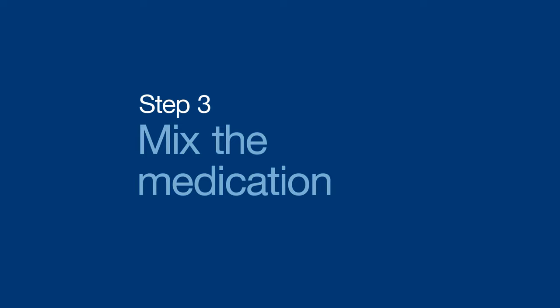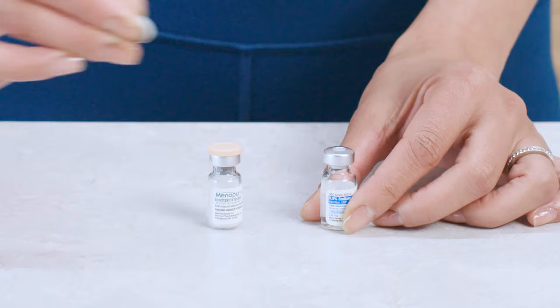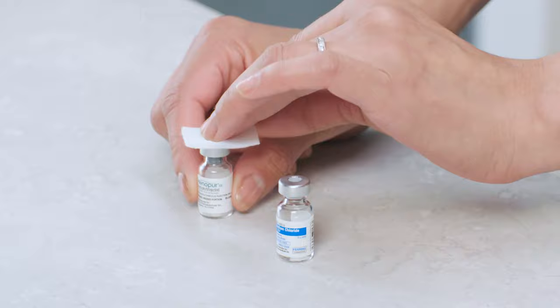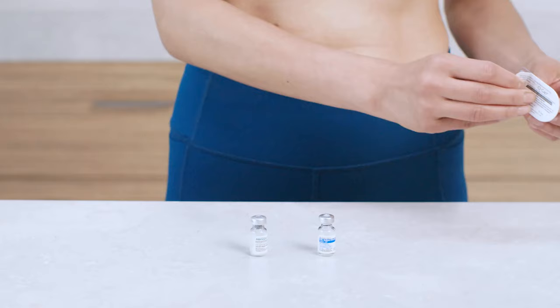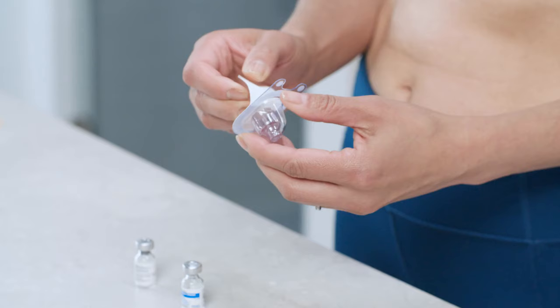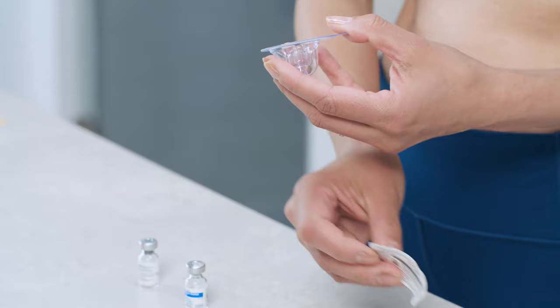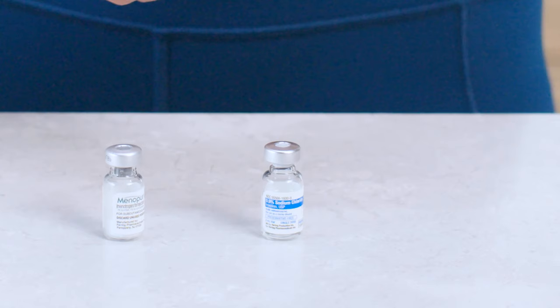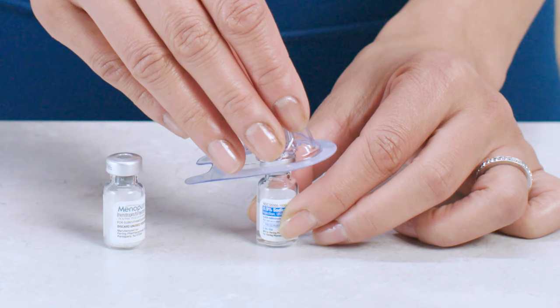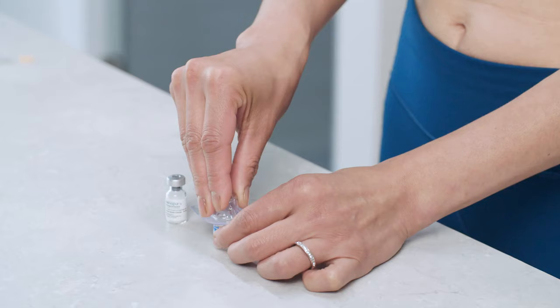Up first, you're going to mix the diluent with the powdered Menopur. To get started, remove the caps from both vials and wipe the tops of each with an alcohol swab. Then peel open the Q-Cap pack — you'll want to keep it in the package for the next step, just be sure not to touch the spiky part. Place the diluent on a flat surface and hold the sides of the vial. With your other hand, turn the Q-Cap pack over and place the open part on top of the vial.